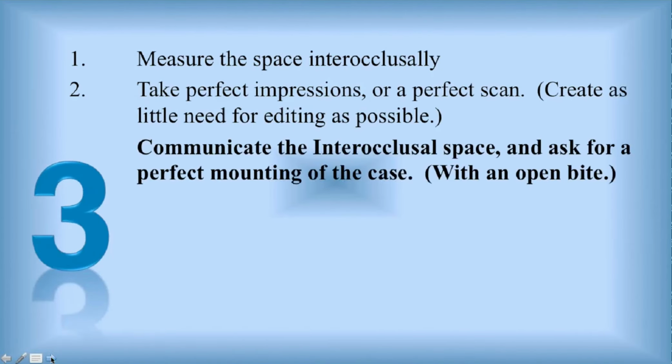The third thing you're going to do is communicate the interocclusal space and ask for perfect mounting of the case with the open bite. I just use a little sheet that says how much space there is between the teeth, and I put that right in the box.